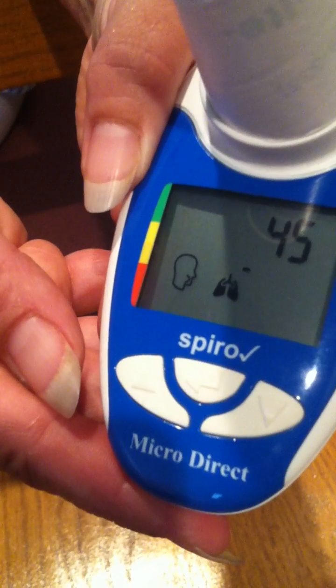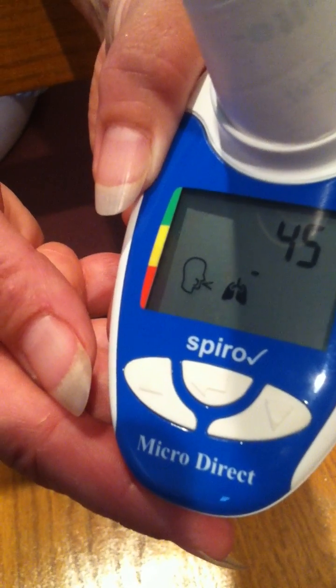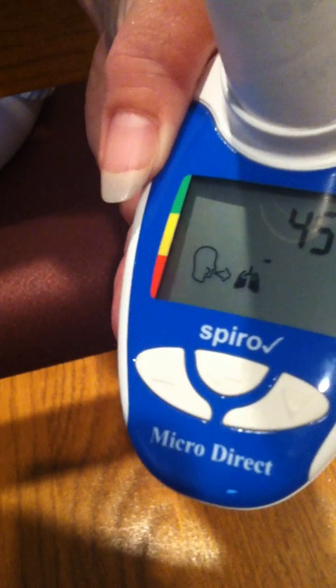Now the test is complete. Turn the unit off by pressing the white button at the top right.